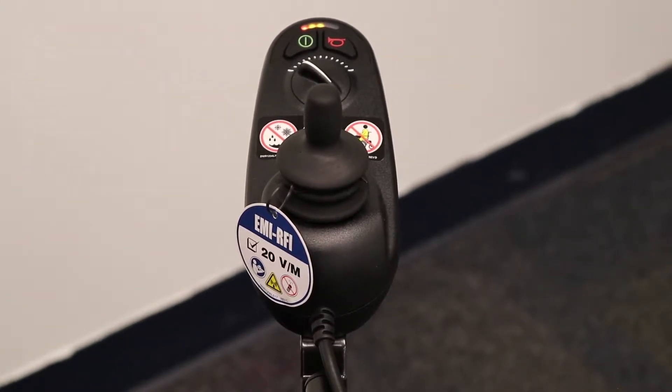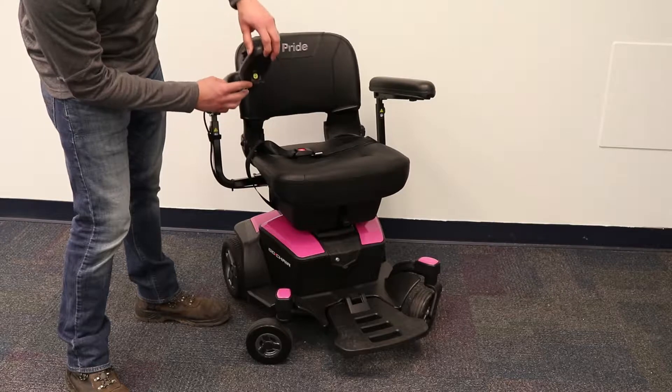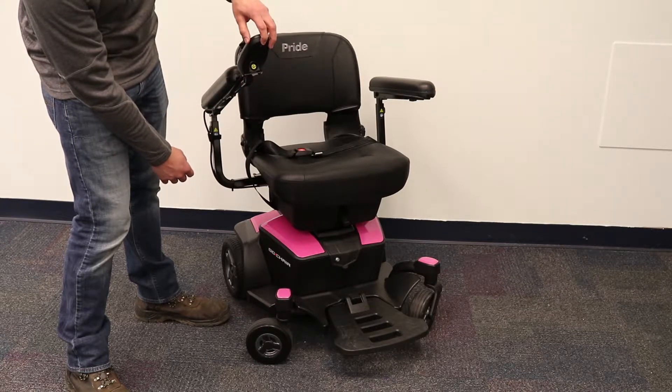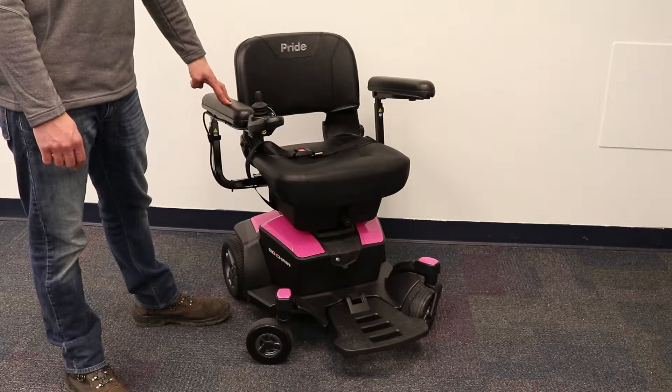Lastly, on the front of the joystick, you have a charging port. This is one of the ways you can plug your power chair in to charge it every night. For more information about your charging habits, be sure to check the description below for a link to our blog about how to maintain your batteries properly.